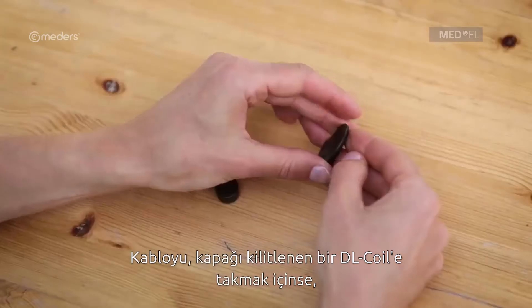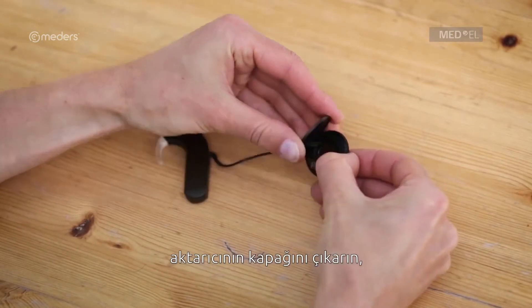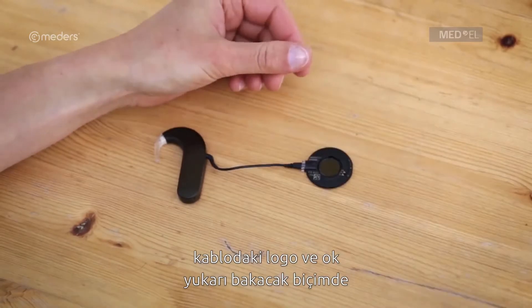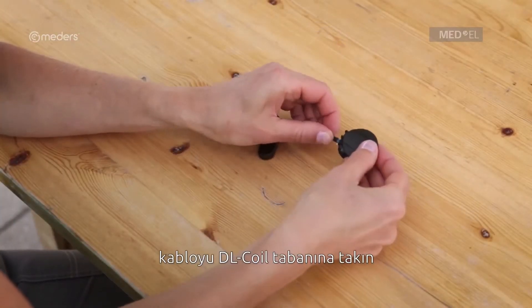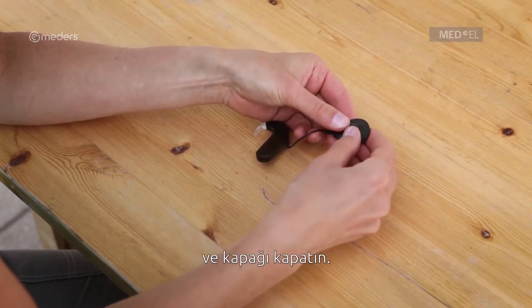To attach the coil cable to a DL coil with a locking cover, remove the coil cover, plug the coil cable into the DL coil base with the logo and arrow on the coil cable plug facing up, and close the cover.